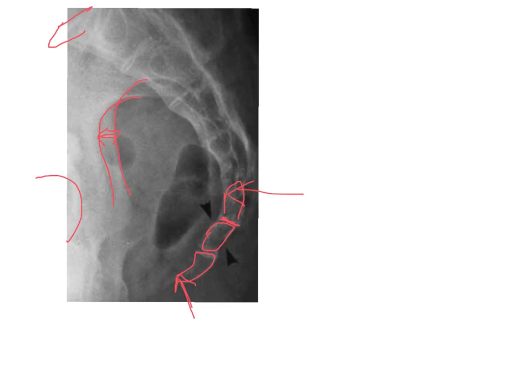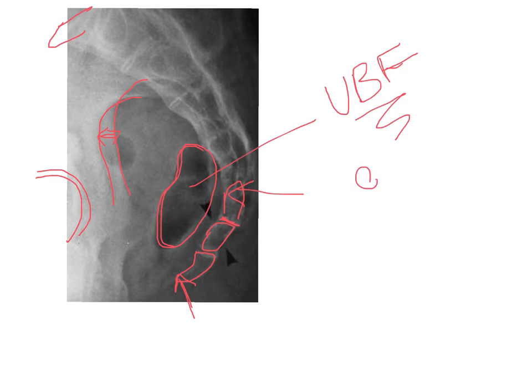have gotten a good look at the femoral head sitting within the acetabulum, and that is another good indicator of rotation or lack thereof. You're seeing this blackened area here. This is not pathology. It is not really anatomy. It is what we call a UBF, an unborn fart, fellows and friends, or simply gas in the intestines.